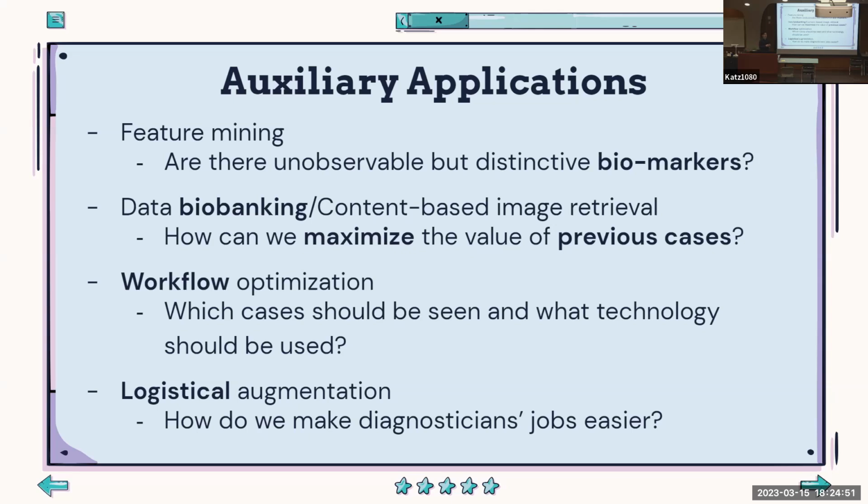So they'll do things like, how many runs in a row of the same gray color are there within this tumor? And the computer can use that very effectively to demarcate borders or decide whether or not a tumor might be more malignant. Whereas obviously for us, there's no way we're zooming in to each individual pixel and counting, like, oh, this one has the longest run of 7. It's just infeasible for us.